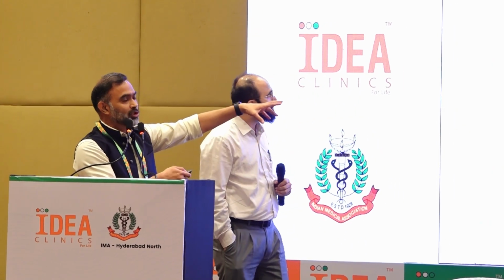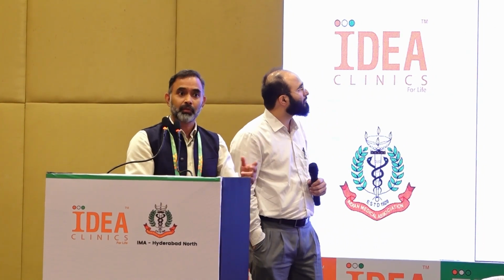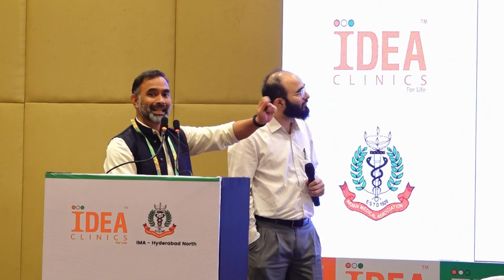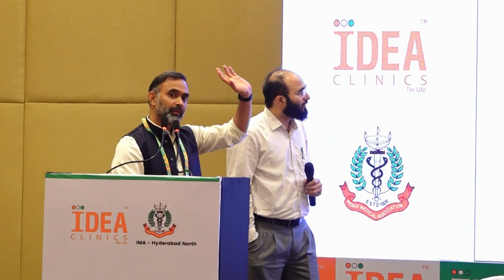So this sensor has to be changed every 7 days. Medtronic is going to upgrade to Abbott Instinct next year, which is going to be every 14 days. The cannula, now we are changing it every 3 days. It's going to be every 7 days.